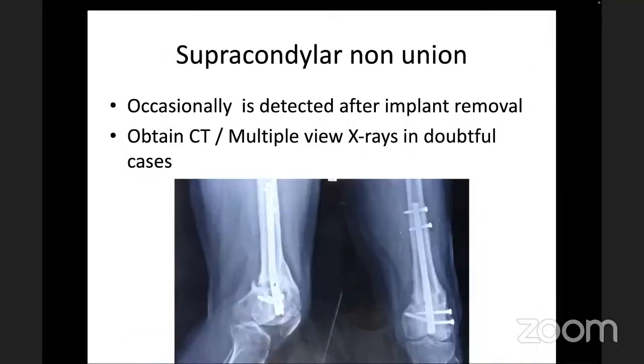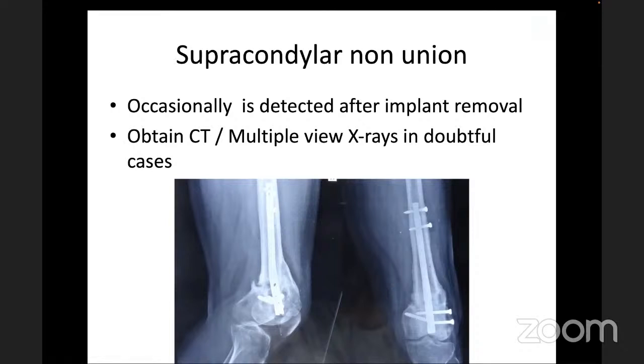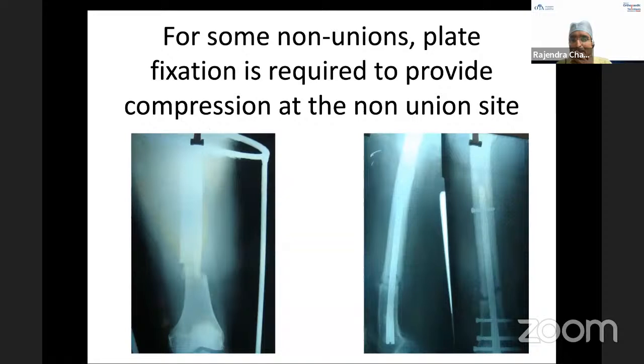Sir, please go back. The placement of the nail you see here, the supracondylar nail in lateral position, you will find there is a reversal of the curve of the nail. He has done it, and it is totally wrong. Not because of the nailing per se, he doesn't know how to do the nailing and how to use the curve. So he has used it in the reverse fashion. Suboptimal fixation is one of the main causes of non-union in a distal femur. Many times you'll find the optimum fixation itself was not there. I know the case, who has done it.